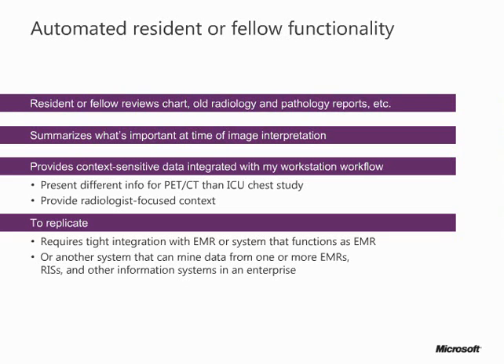And then also what I want from this intelligent system is for it to provide context-specific and sensitive data that's integrated with my workstation workflow. So, for example, the information that I'd want when I'm reading a PET-CT study would be very different than the type of information I would need if I were reading out an ICU chest study or whether I was doing a body CT study.